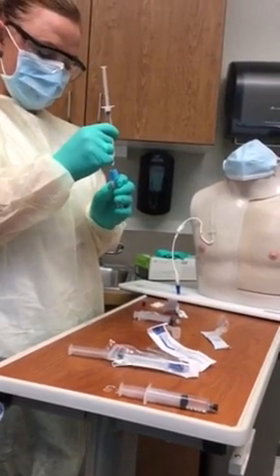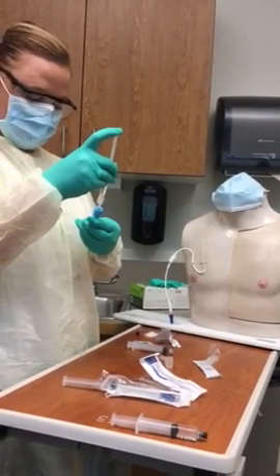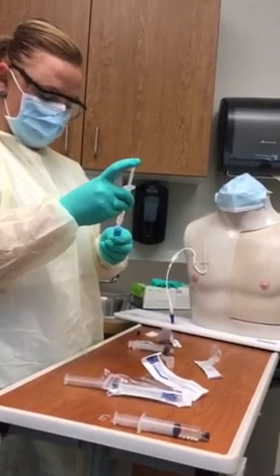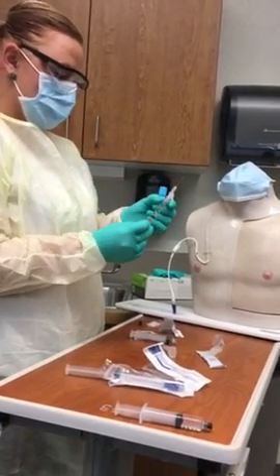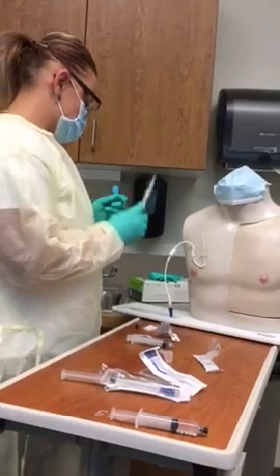Okay. We verify that this was not expired. Make sure that we get it nice and full so lab doesn't call and yell at us. Okay. That's all we need in that one. Go ahead and recap my needle. I'm going to throw this in the sharps container.